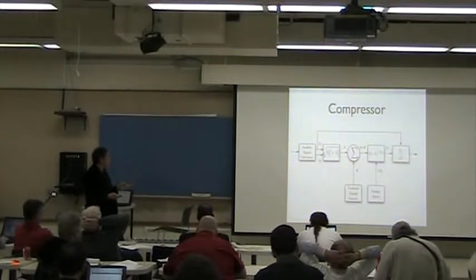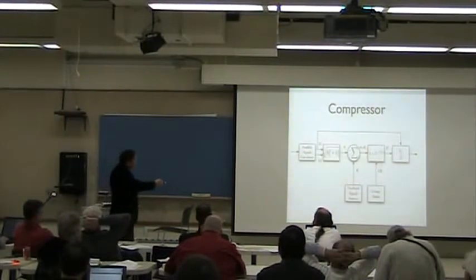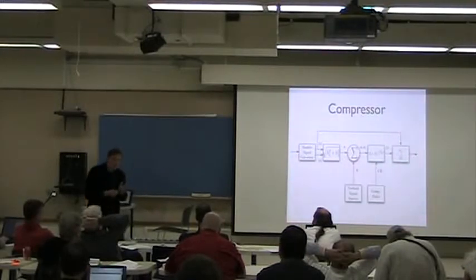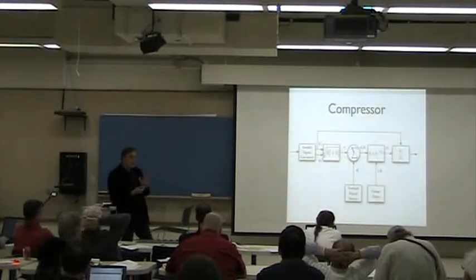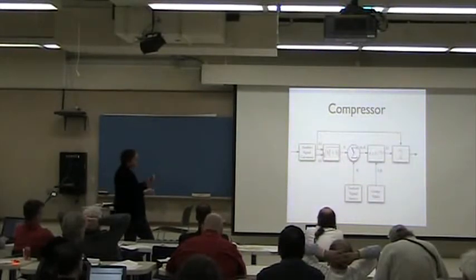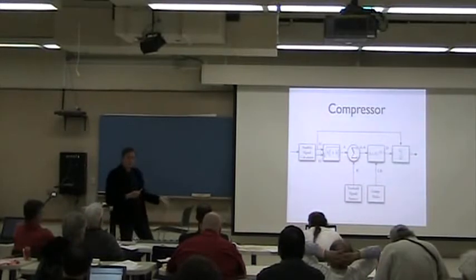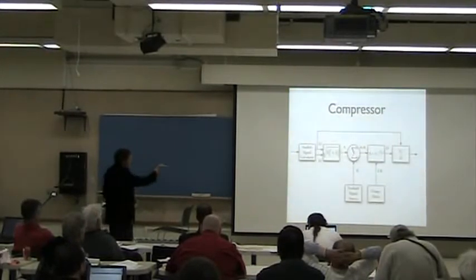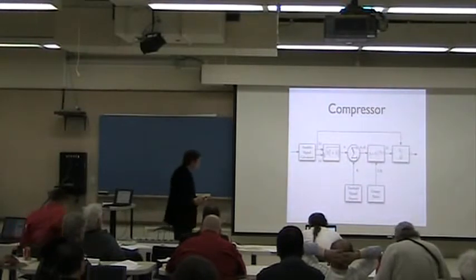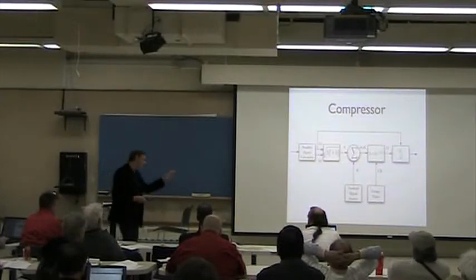And this is because we've got this analytic signal calculator, which basically converts the input signal into the complex form. So we've got the imaginary and we've got the real part. And of course, if you calculate the hypotenuse of this imaginary and real part, the magnitude of the vector, you'll get your envelope instantly. And yeah, it says that you should take a square root of the sum of the squares, but we do it differently. And if I have time, well, actually, yeah, I can tell it right now.